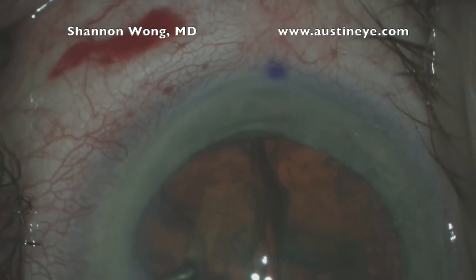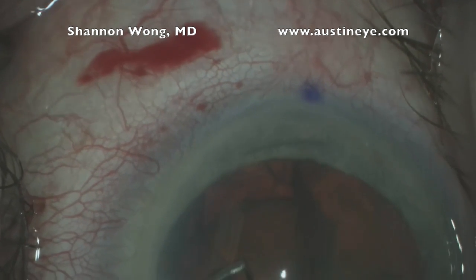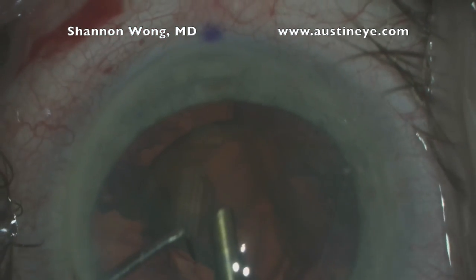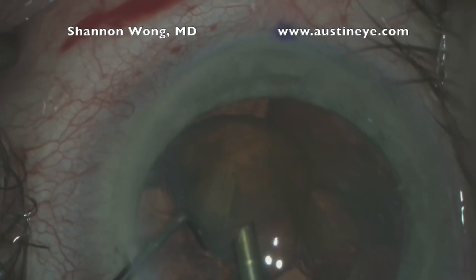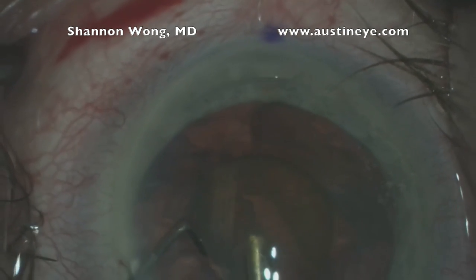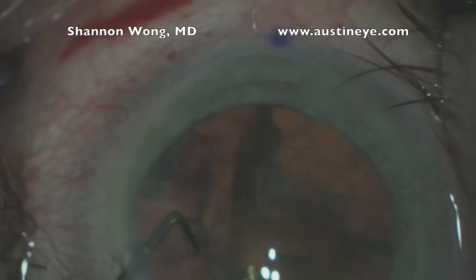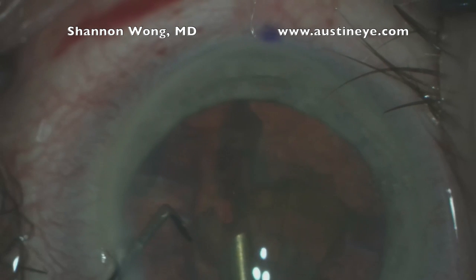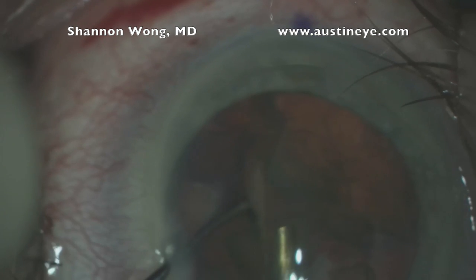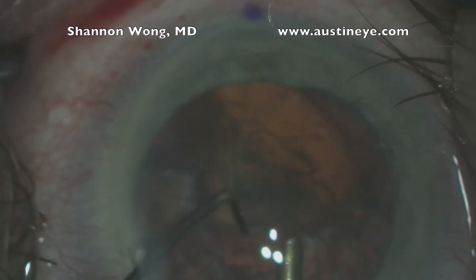The capsulotomies made with femtosecond lasers are made with micro pulses of laser, and by looking at the anterior capsule edge of these capsulotomies there can be small micro perforations that are not completely smooth. If the capsule is stressed at the right spot with just enough pressure, these micro perforations in the anterior capsule margin can extend toward the zonules.